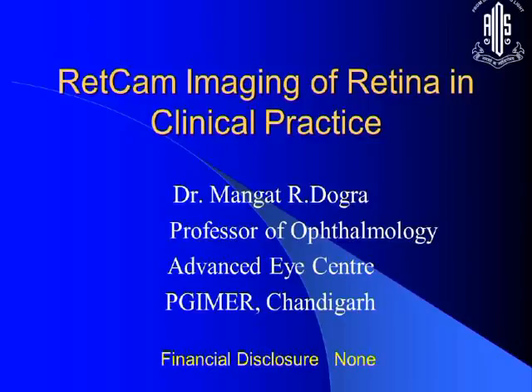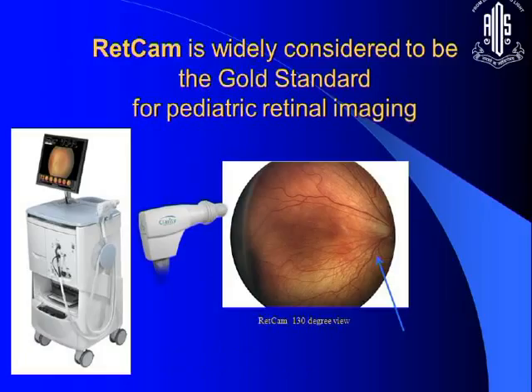I would talk about another modality, wide-angle imaging for pediatric patients, especially very useful for infants. And of course, this has been there for quite some time. The problem is it's still an expensive tool, but very, very useful. So basically, I think as far as pediatric imaging is concerned, this is considered a gold standard.